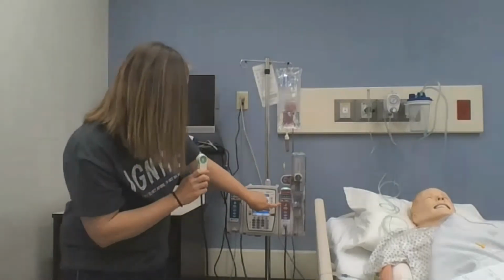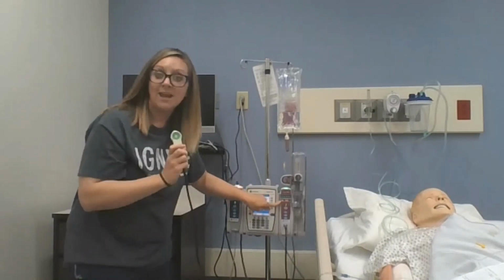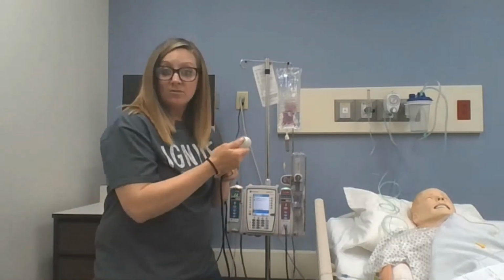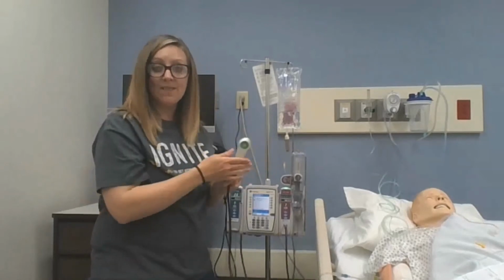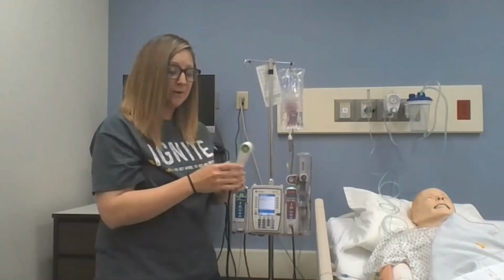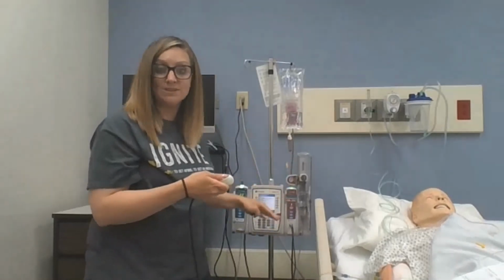So you're going to see after I hit that, it says delivering PCA dose. So you know right now they hit the button and they are getting the medication that they requested. If the patient hits it 2 or 3 more times, nothing's going to happen. It's only going to give them what they had programmed in there. So it's only going to give them what is programmed or allowed. They can hit the button all they want, but it's just going to give them what's programmed into the pump.